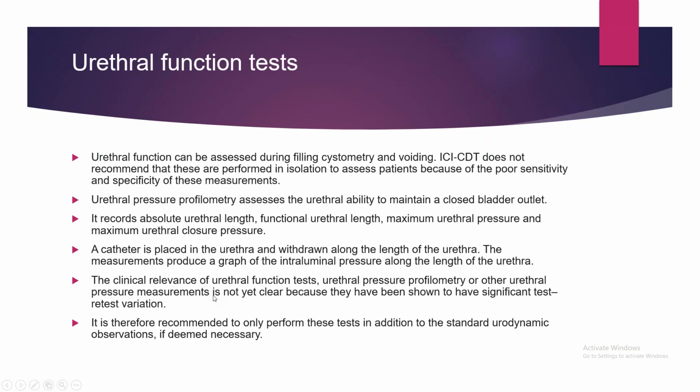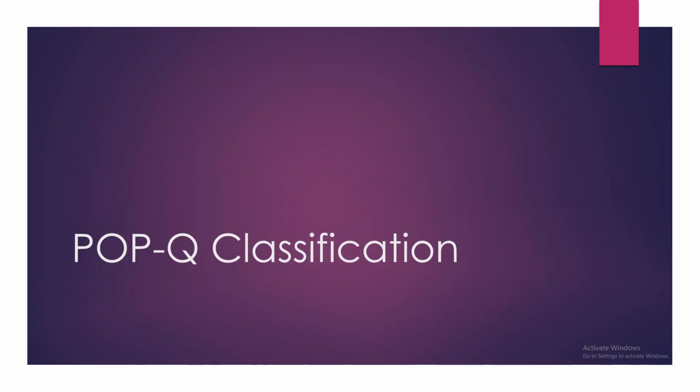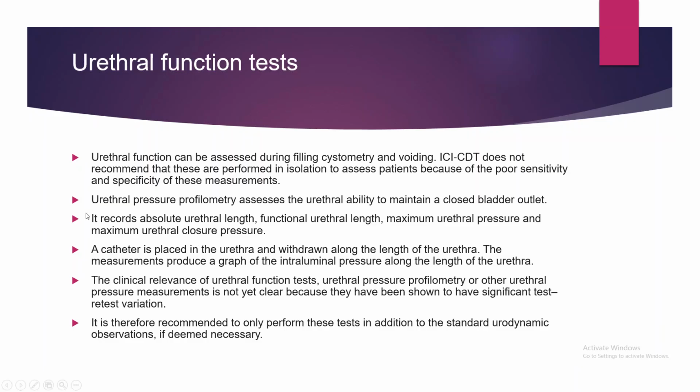But the clinical relevance is not yet clear because they have been shown to have significant test-retest variations. Very significant variations have been obtained, so clinical significance is not yet clear. It is therefore recommended to only perform this test in addition to standard urodynamic observation if deemed necessary. This last sentence is very important: it should not be done in isolation. So this completes the urodynamics.